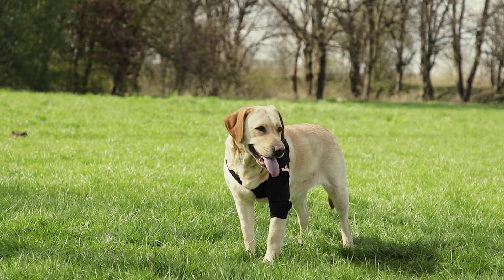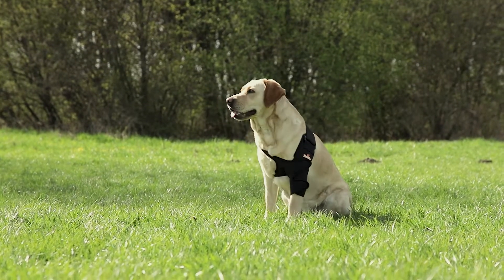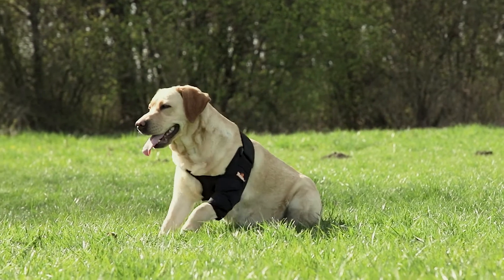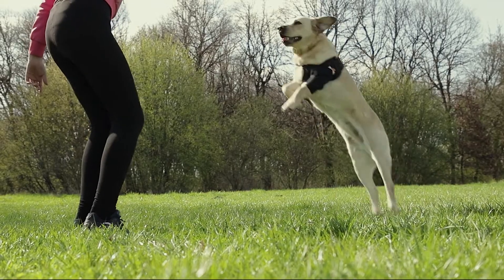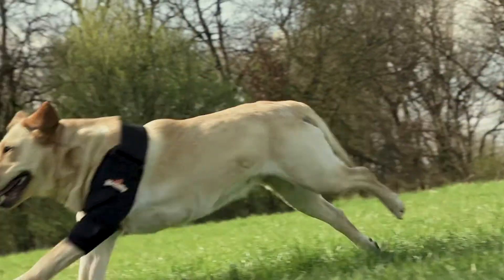This brace protects your dog in all circumstances: standing, sitting, lying down, running, or jumping. It stays in place to provide the much-needed elbow and shoulder support, but still allows freedom of movement. Your dog will find it very comfortable.